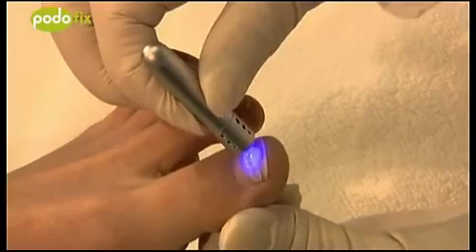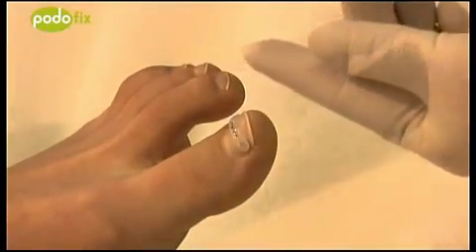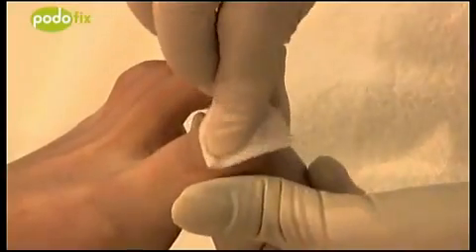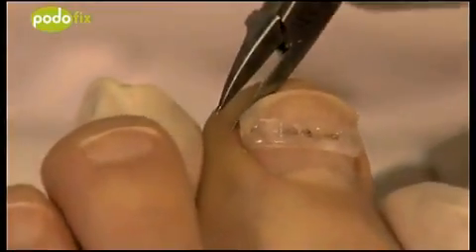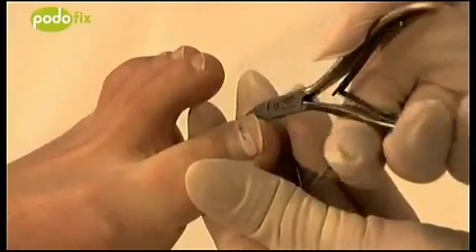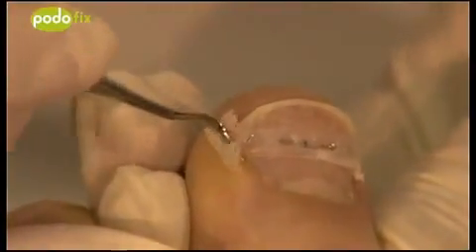During hardening, an oily layer will form on the surface of the gel, which can be easily removed using the alcohol swab. Nail edges are removed if required, and the nail crease is then plugged or treated as one would a wound, depending on the situation.